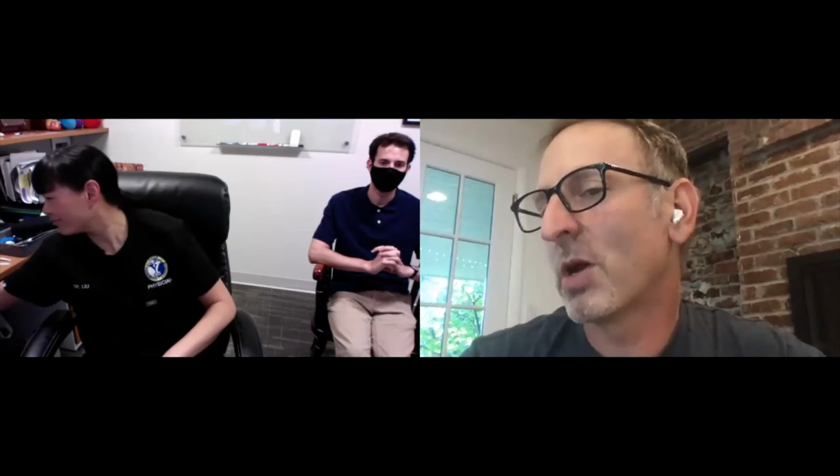All right, we've got about 10 minutes or so. Do you want to try and do a little bit of live scanning? And we'll see how that works. Does anyone have a particular thing that you want us to scan? I'll throw it out to the audience. If not, we can try to get Doug's suprasternal notch. I'm keeping an eye on the Q&A feed here to see if anybody has particular things they want us to try and scan live. If you do, go ahead and throw it in there. Somebody wrote a radial artery, so that's an easy one. Thyroid.